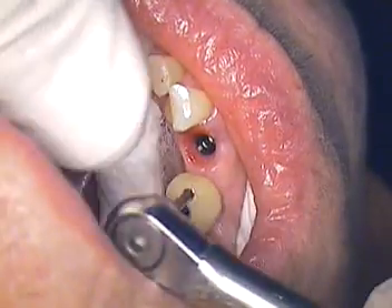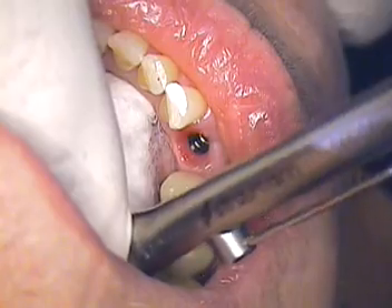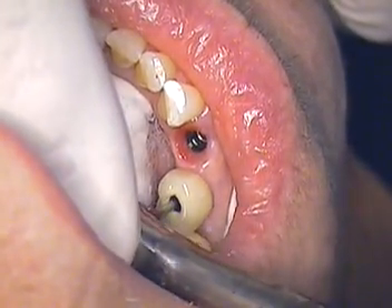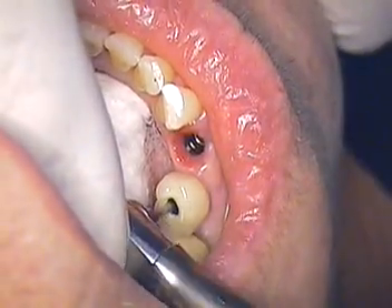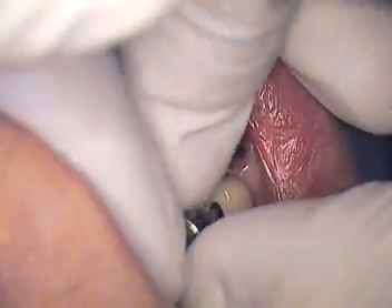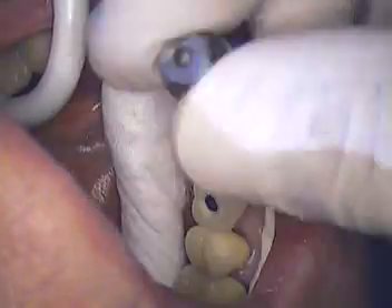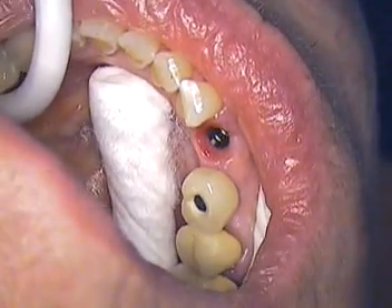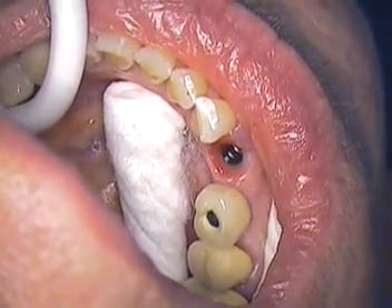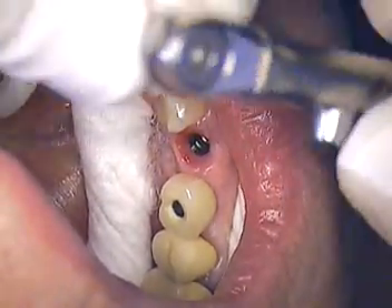The tissue looks relatively healthy. I'll hand tighten that first. Julia, I'm going to ask how you feel once I hand tighten that — just make sure you're not feeling any tension or tenderness in the tooth at all. Nothing on the adjacent tooth. Now I'm going to start to tighten it a little bit more — just give me some feedback on how you feel.